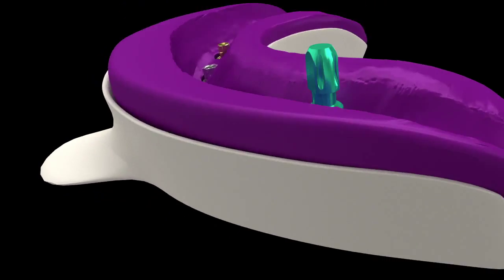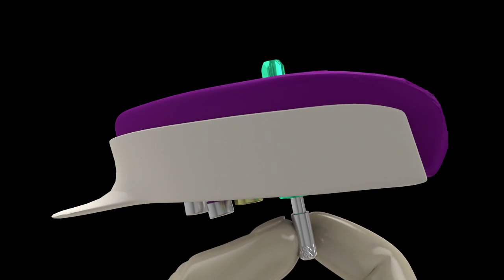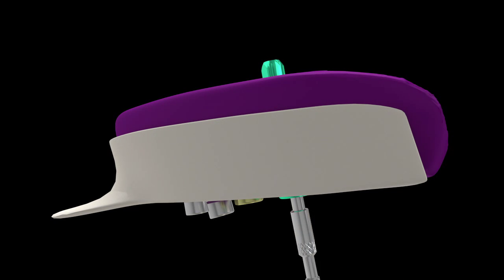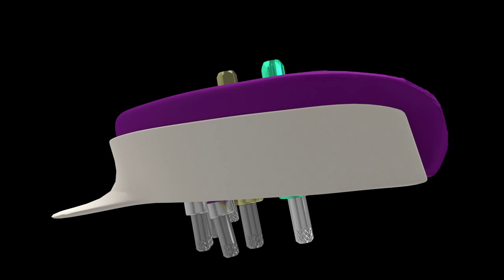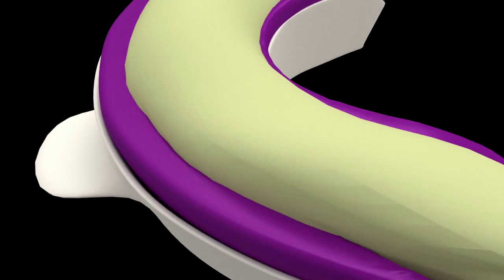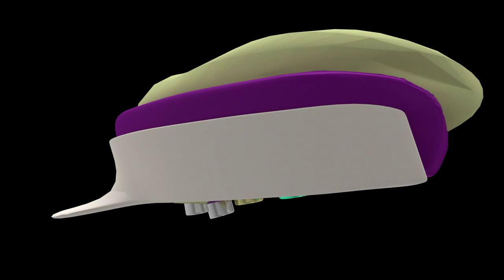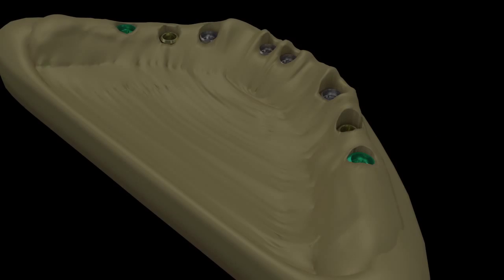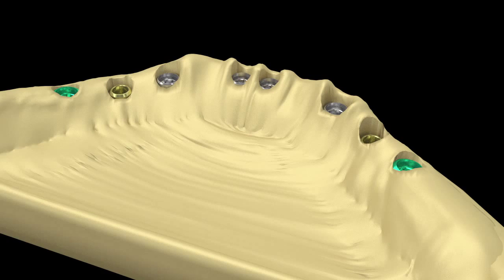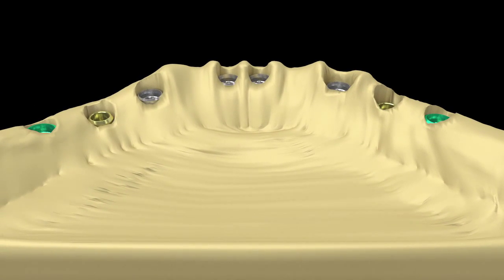Analogs with colors that match their respective copings are placed and secured by impression coping screws. Die stone is poured to create a working model. Upon setting, coping screws are removed and the model separated, accurately reproducing the clinical case thanks to the use of Smart Transfer Impression Copings.